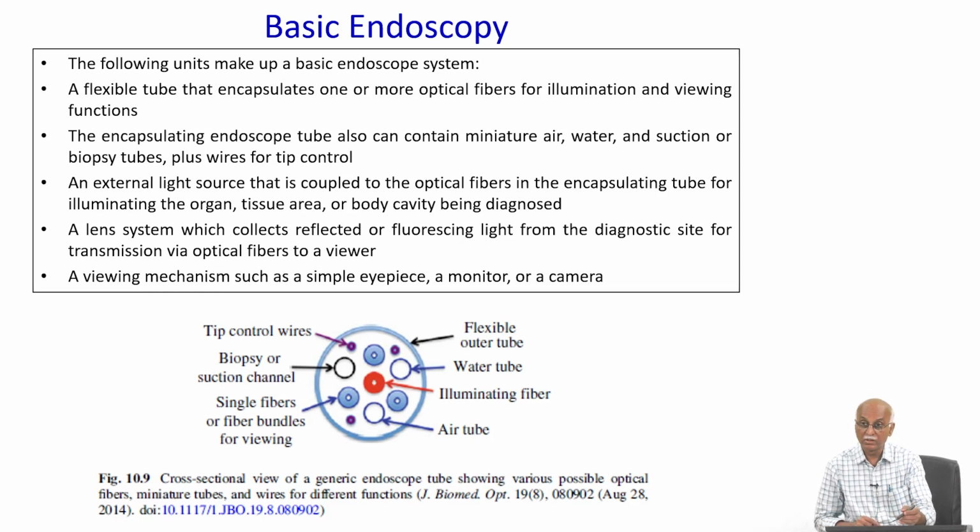One of the applications is that we can use it for endoscopy as well, with a similar approach, wherein optical fiber will bring the light here. So, the sample arm will carry the optical fiber and the endoscope will go to a certain region, let us say in gastroenterology, passing through the esophagus and into the stomach.